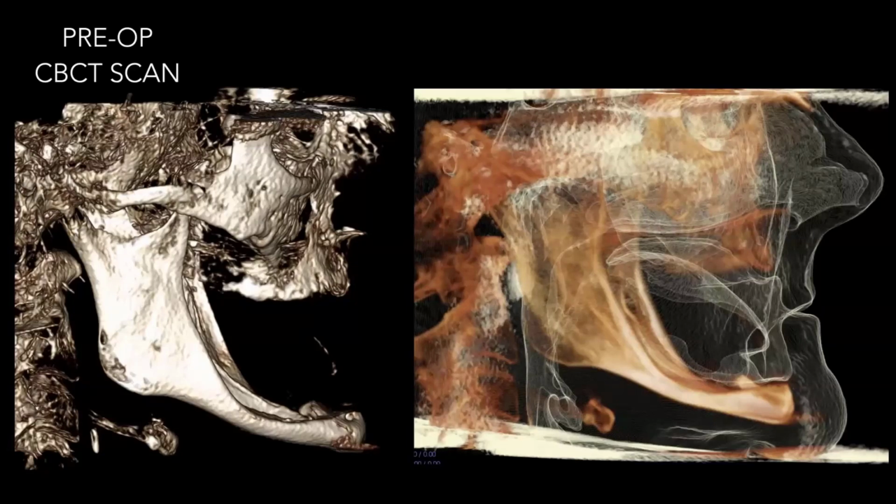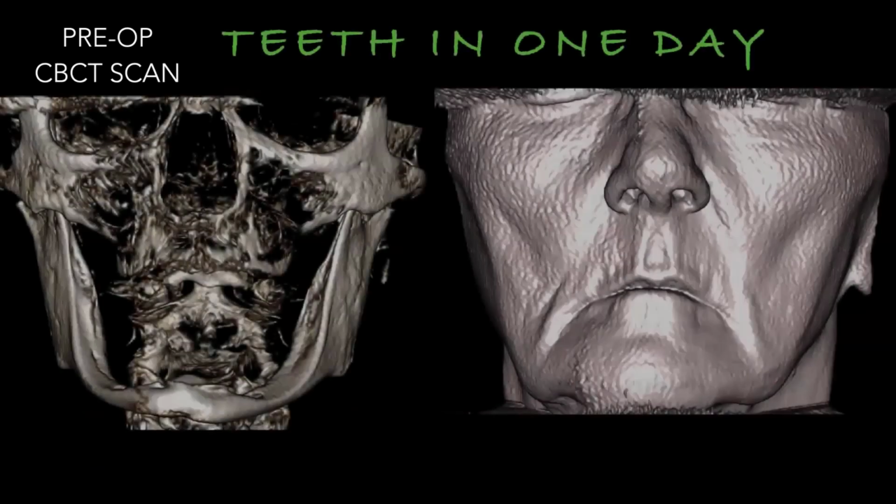And these are all just from the same 5-second scan or 6-second scan, super low radiation. This is not a high radiation scan. This is the only scans we take. We don't take high radiation scans. We take the lowest scan always. And that's what all the images you've seen are, those scans.